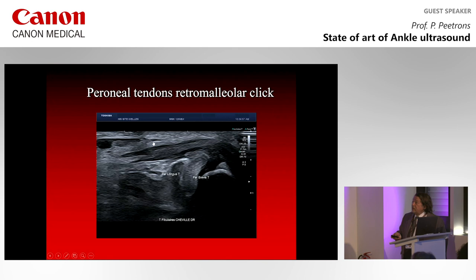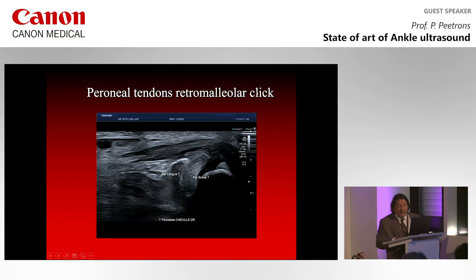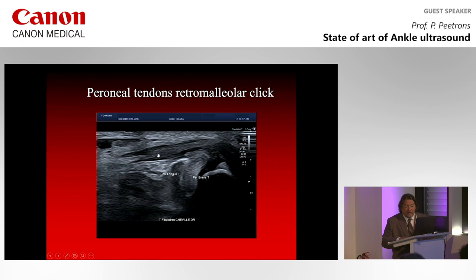Something that is not very well known is the retromalleolar click. So what happens? The patient comes and says, I have some pain, and I hear, or I feel, a click when I do some movements. So I ask her to do these movements and try to find what happens. First of all, in this picture, you can see that the retinaculum of the peroneal tendons is much bigger than normal. Normally, you have a very fine line with a little triangle here. In this case, you don't have this.